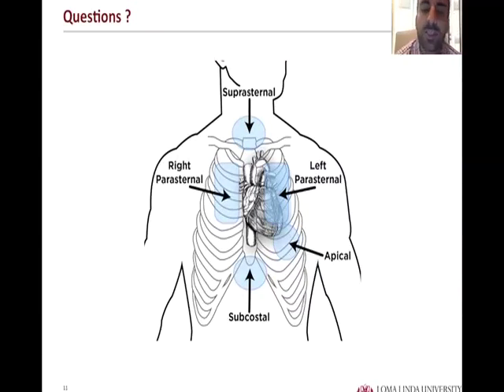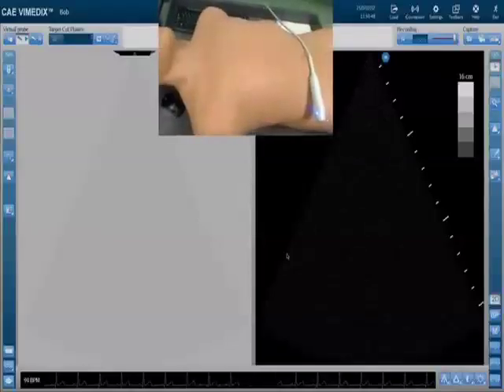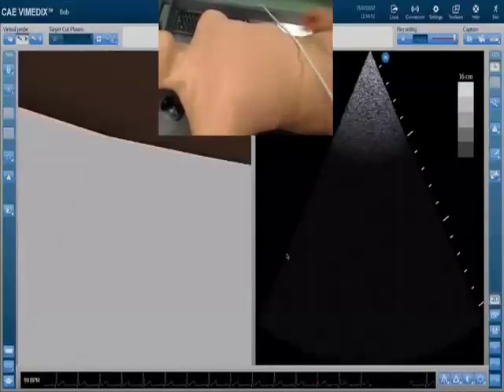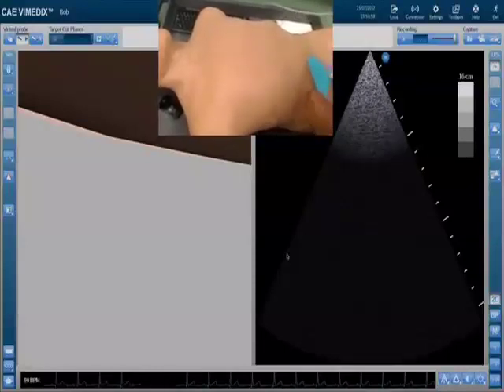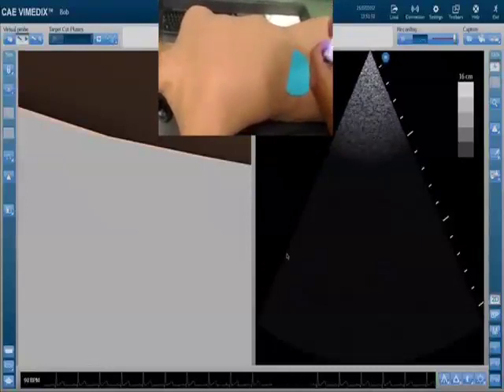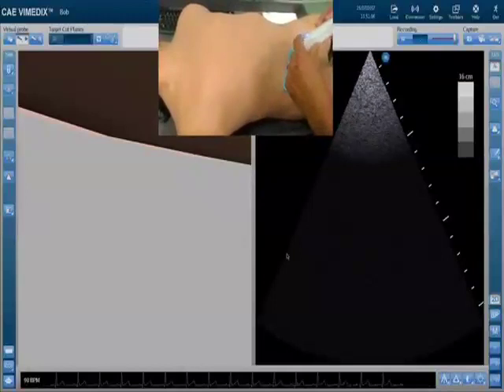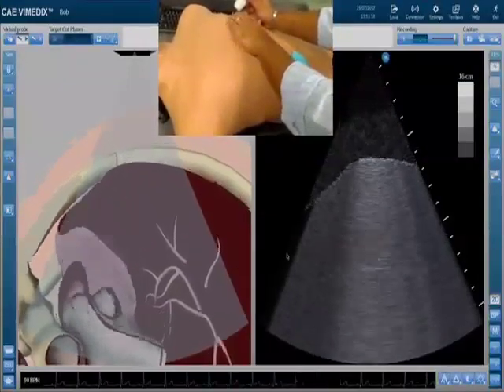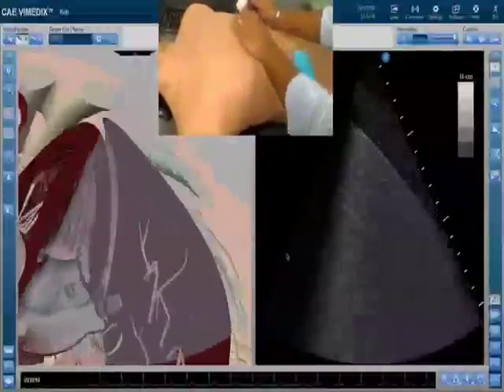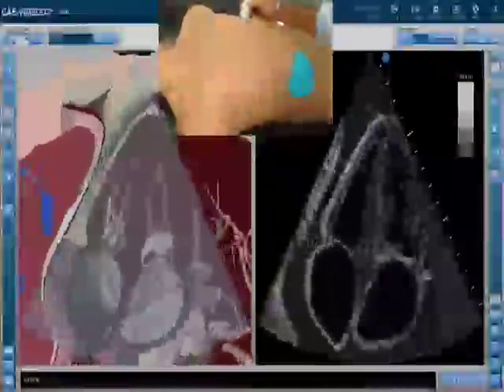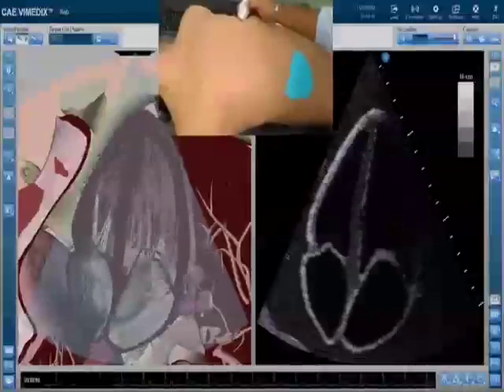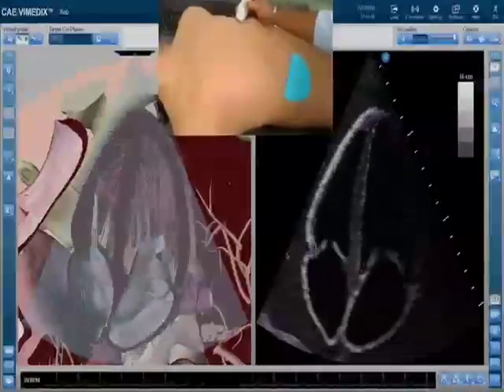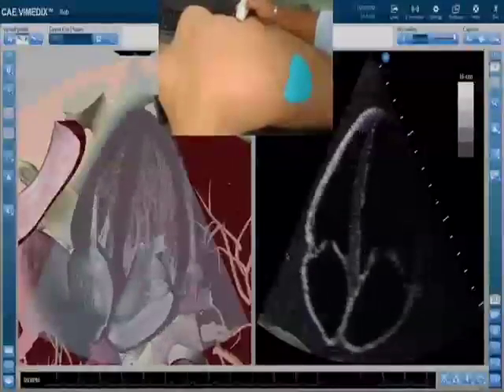That was a brief overview of the apical section; we'll now go on to the hands-on demonstration via the simulator. The goal of the apical window is to have the ultrasound plane shine through the apex of the left ventricle. To get the apical four-chamber view, have your indicator aiming at the 2 to 3 o'clock position. Start by identifying the patient's PMI, or go one or two rib spaces below the nipple line, around the 6th to 7th rib space. Lower your angle to get a cross section through the left ventricle — right ventricle on the left side of the screen, left ventricle on the right, with the mitral and tricuspid valves accordingly.